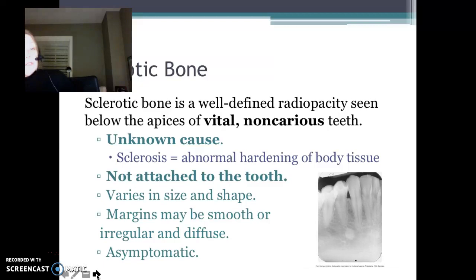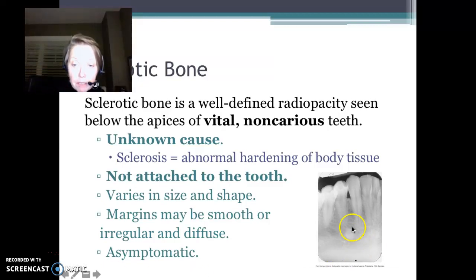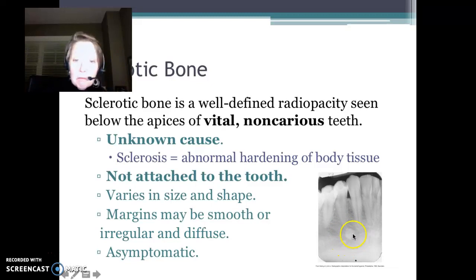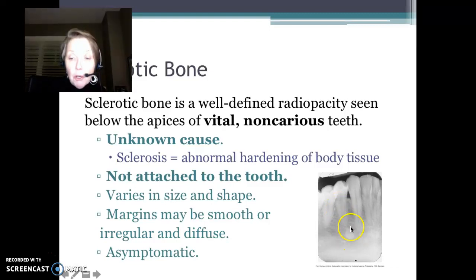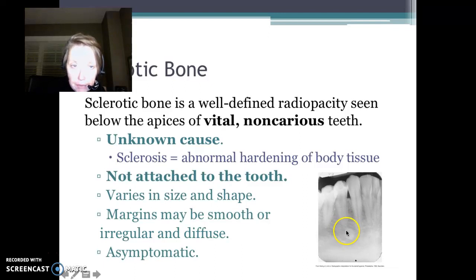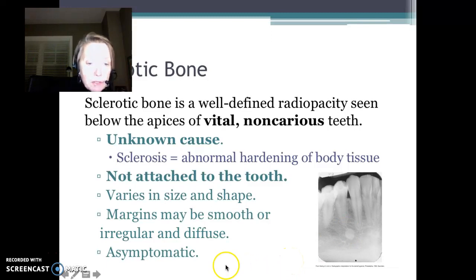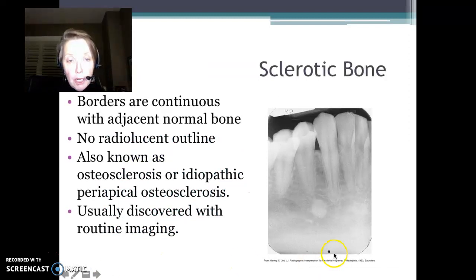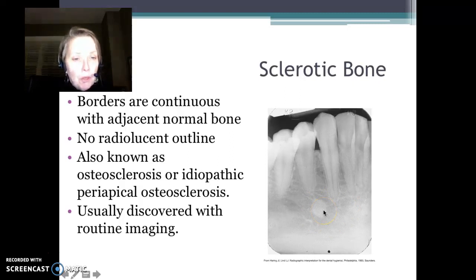Sclerotic bone is another radiopacity — in this case, a very well-defined radiopacity below the apices of healthy, vital, non-decayed teeth. The cause is unknown. It's not attached to the tooth — you can see the bone separating the apex of the root, then alveolar bone, and then this sclerotic radiopacity. The patient is asymptomatic and wouldn't know they had it until you take an image.